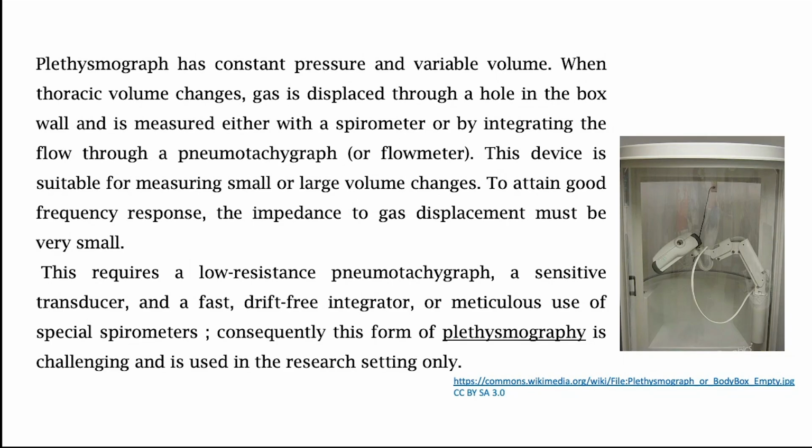And one might think that bigger rooms or bigger chambers will essentially give better measurement. This is not true. Actually, as the volume of the room keeps increasing, making it seal proof becomes more and more difficult.